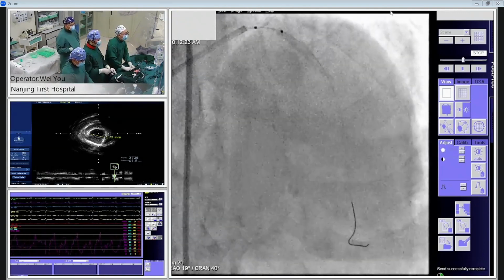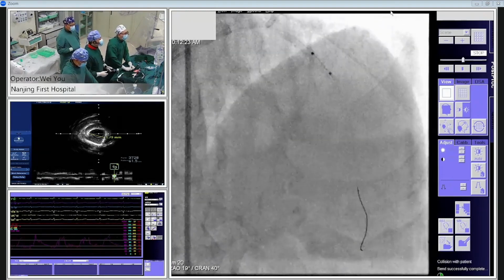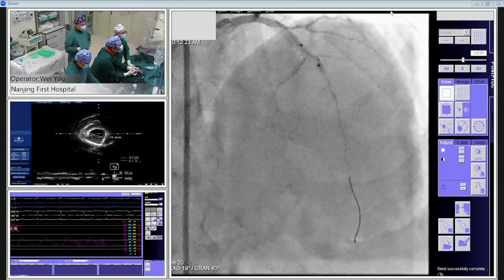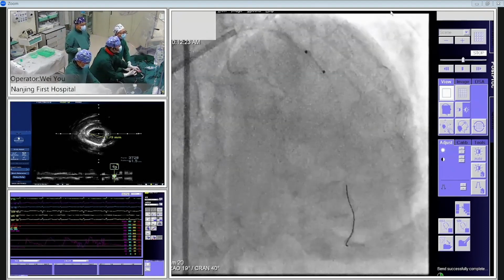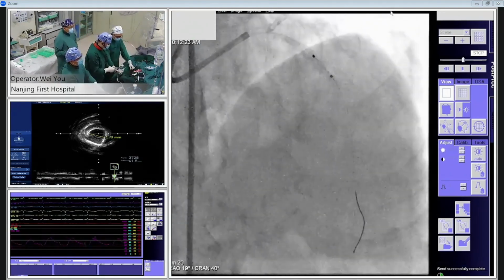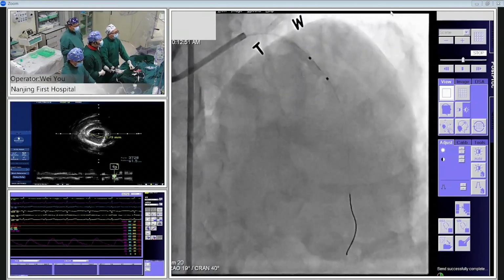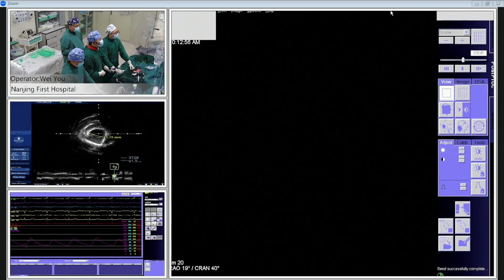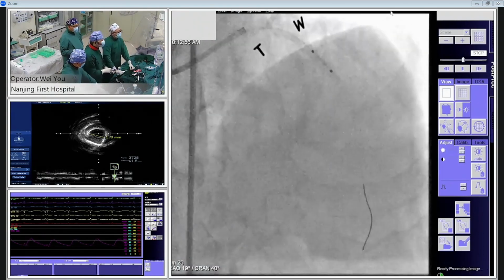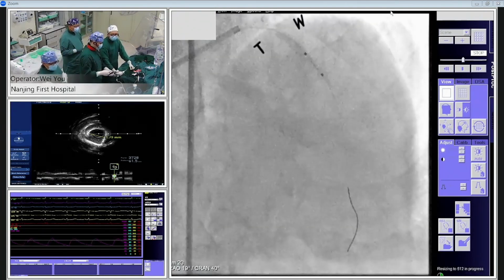Okay, Chief, we just deliver the balloon. Seems okay. Please give some test. I think we don't need it. Okay, just here, it's good. Go to 4. You have some bubbles, so the balloon does not show very clearly.